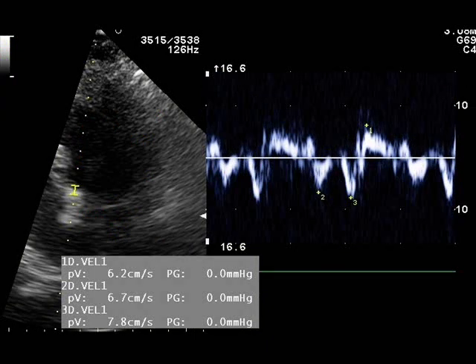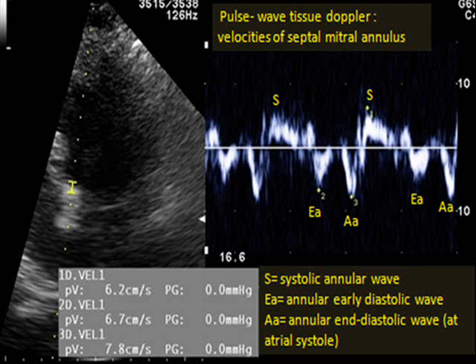The tissue Doppler measurement of the velocity of motion of the septal or lateral mitral annulus is also an index of systolic and diastolic function. The mitral annulus moves towards the heart apex in systole and towards the base in diastole. There is a positive systolic wave (S wave), a negative early diastolic wave, and the mitral annular E wave. A reduced velocity of the mitral annulus E wave indicates diastolic dysfunction. Here the E wave of the mitral annulus has a peak velocity of 6.7 cm/s, which is moderately reduced, consistent with a moderate degree of diastolic dysfunction.